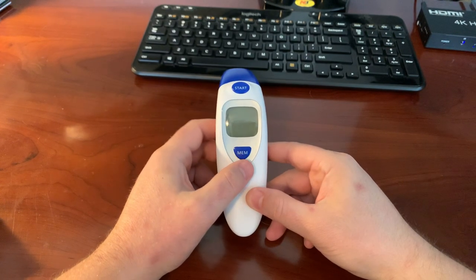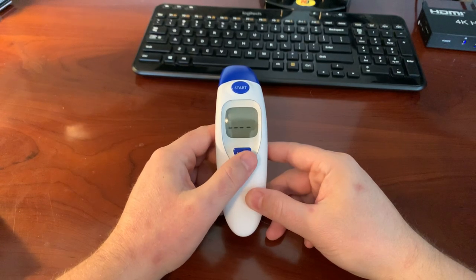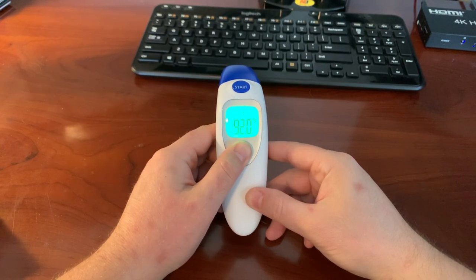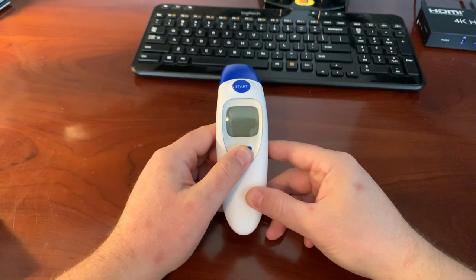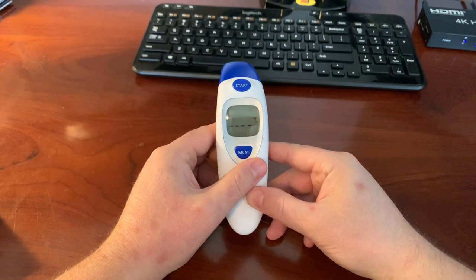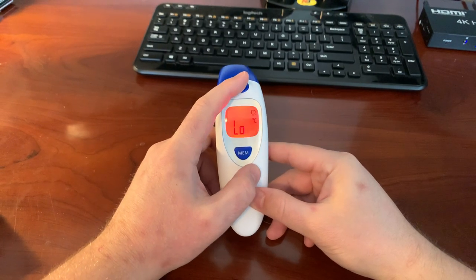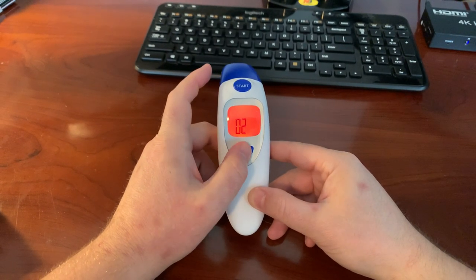With it off, hold down the memory button for six seconds and this screen is going to show up with degrees Fahrenheit blinking. Hold the memory button to turn it off again, hold it for six seconds, then tap it once — degrees Celsius, again degrees Fahrenheit, vice versa. Then just let it turn off normally, and when you start it up it's now in degrees Celsius.